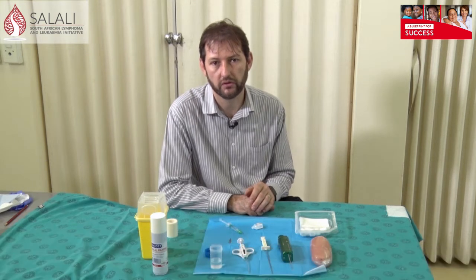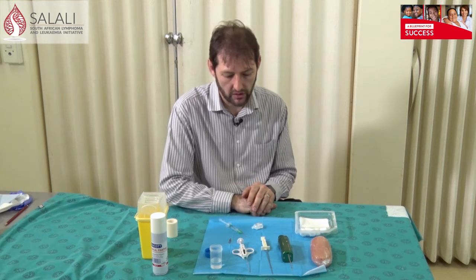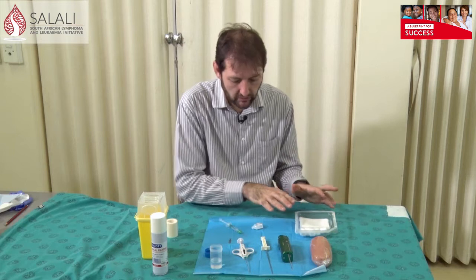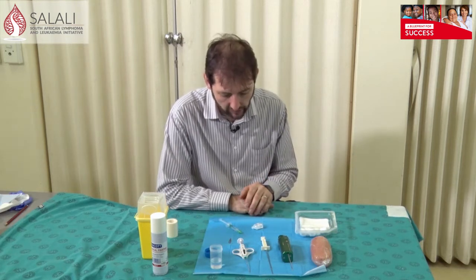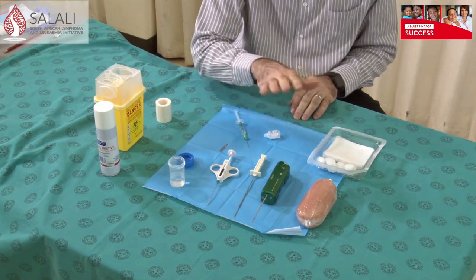For the next section I'm going to show you how to do core needle biopsies for histology on a tissue specimen, to give you an idea of how it works in a real case scenario. I also want to show you what the packs look like that we use for the procedure. It's the same setup — you can use a dressing pack, and I've got my different options of needles here.